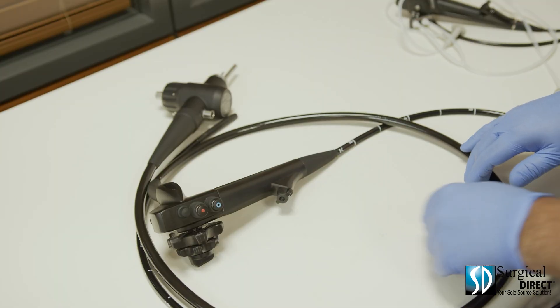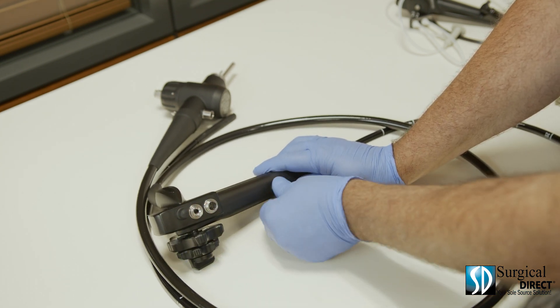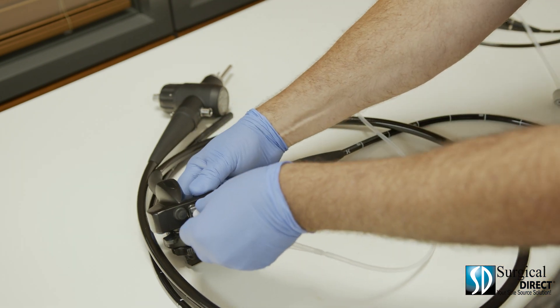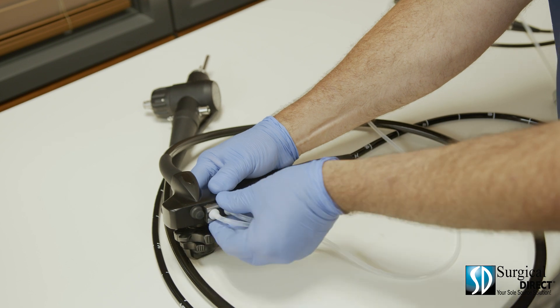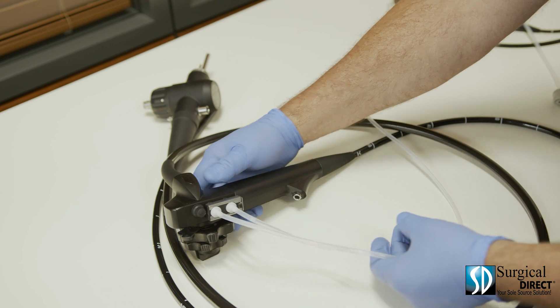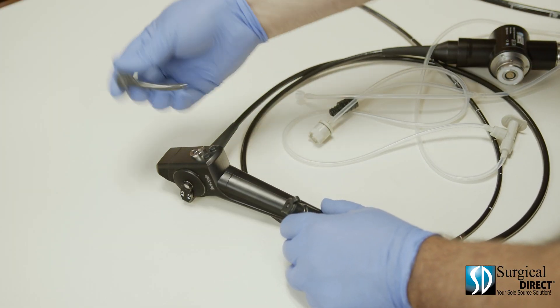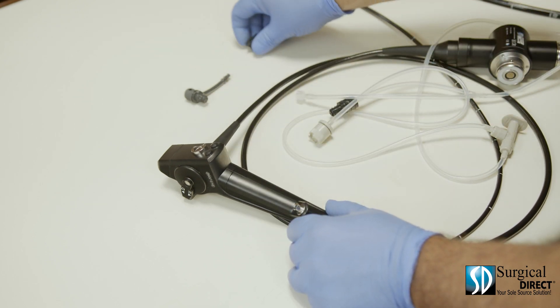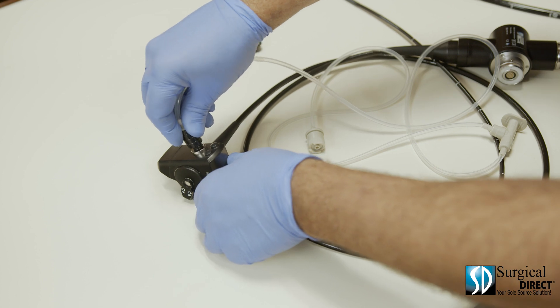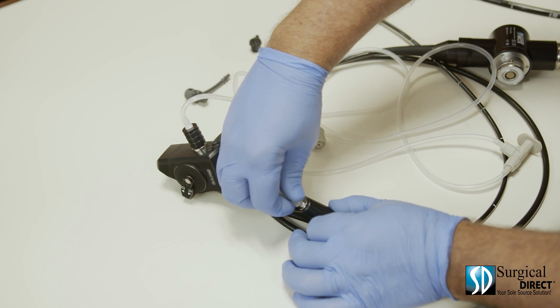Each scope comes with a cleaning adapter. Simply remove the air, water, and suction valves along with the biopsy port cap. With the small end up, attach the cleaning tubing to the control body of the scope and make sure it's locked on. The cleaning adapter for the bronchoscope is a little different: remove the suction valve, remove the biopsy port cap, insert the black end into the suction hole, and attach the luer lock to the biopsy channel.